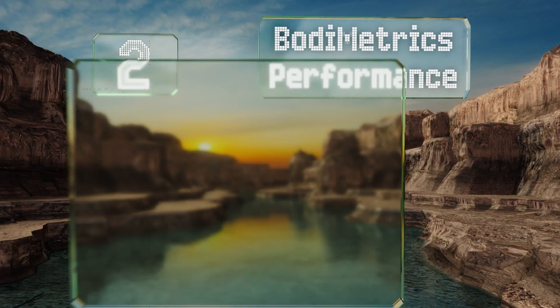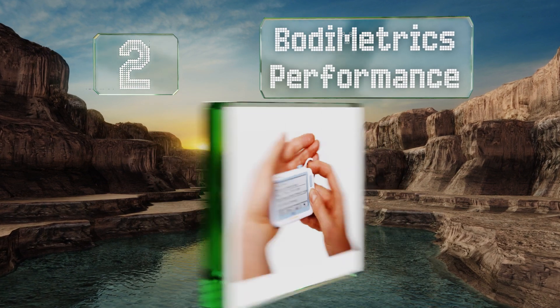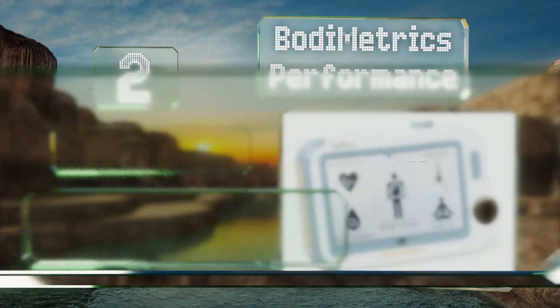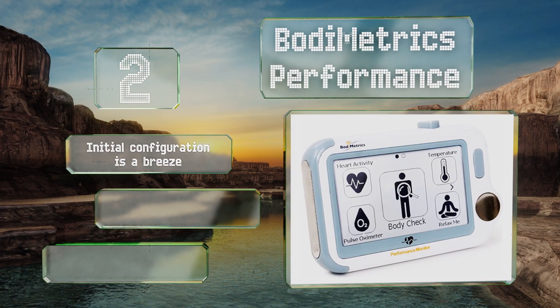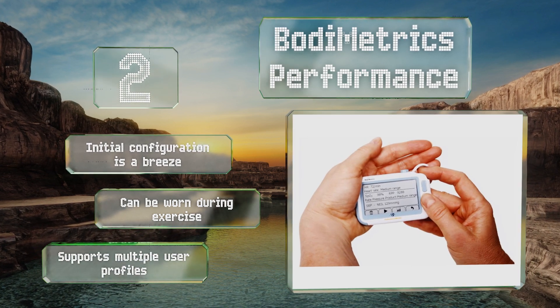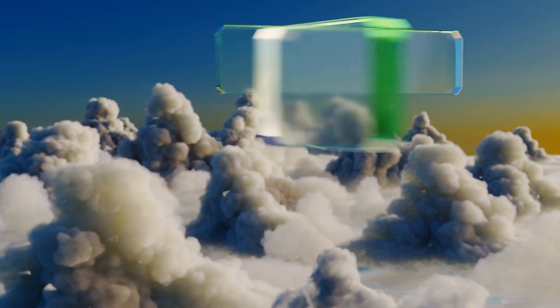At number two, the Body Metrics Performance is like having your own personal physician in your pocket. In addition to checking up on heart health, it also tracks activity, reminds you when it's time to take medications, and tests your blood pressure. Its initial configuration is a breeze and it can be worn during exercise. It supports multiple user profiles too.